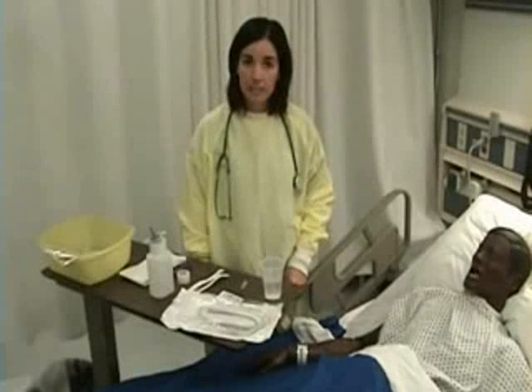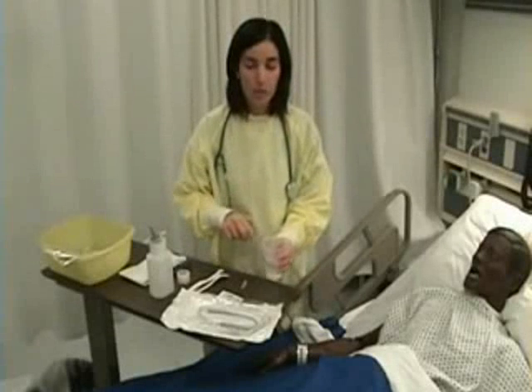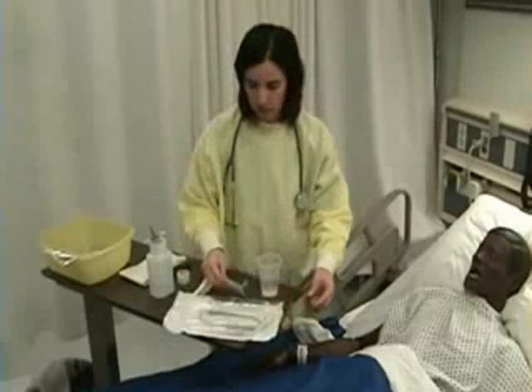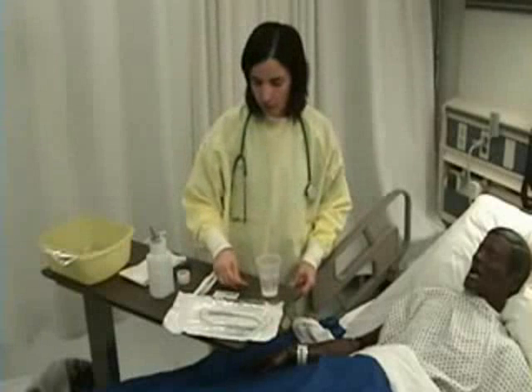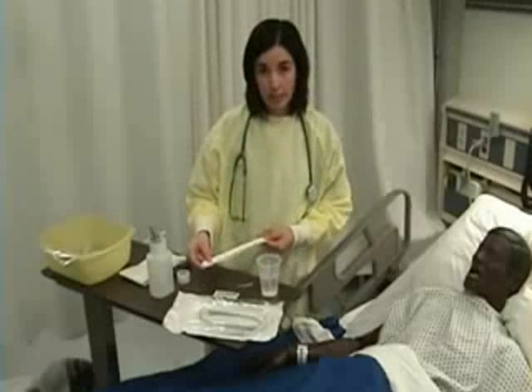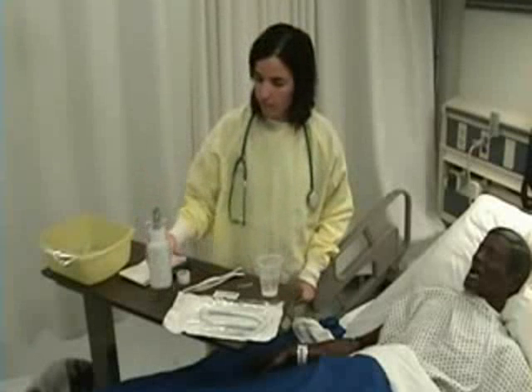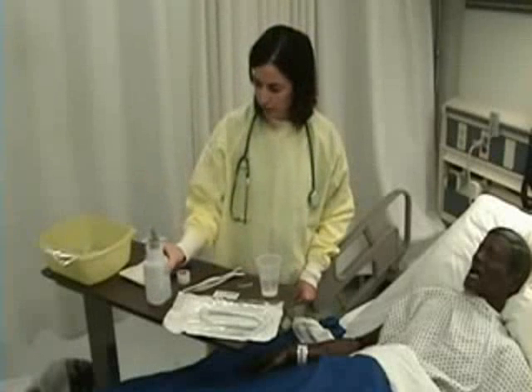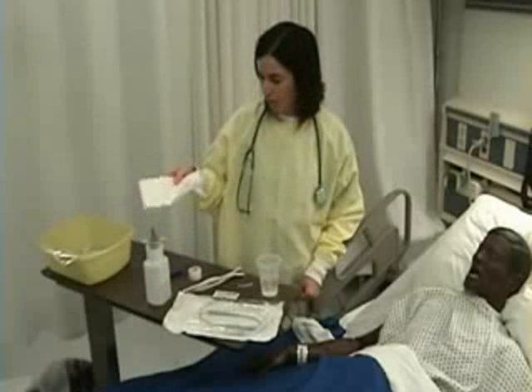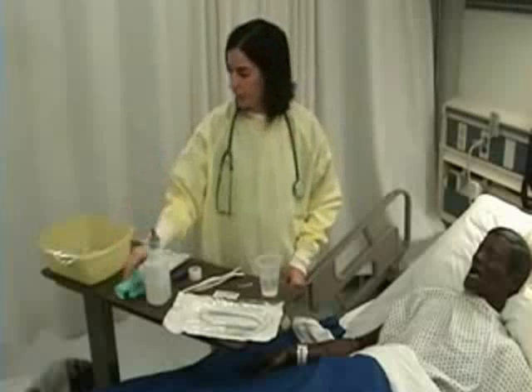Now I will gather my supplies to take to my patient's room. I need a cup of water with a straw for my patient to sip during insertion of the tube. I need my NG tube, a lubricant, a pH strip or litmus paper, a measuring tape, a 60 ml syringe. This is my bottle of water just for irrigation. Tape, a non-sterile drape to protect my patient's gown, pen light, non-sterile gloves, a basin.